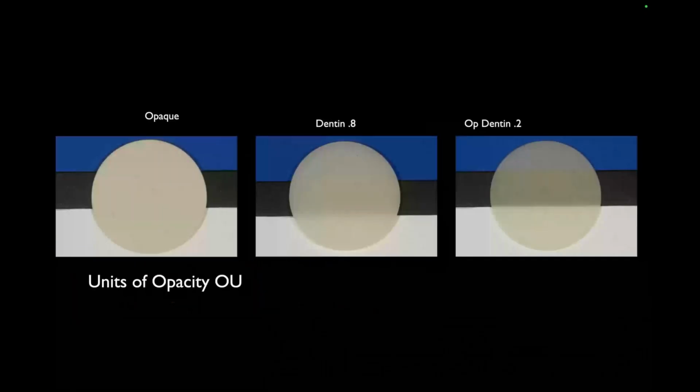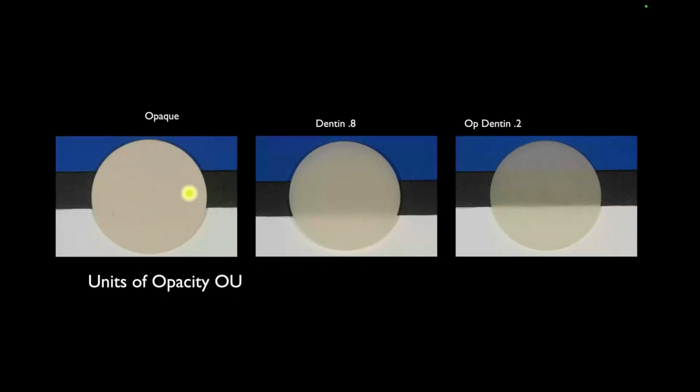So you guys need to understand that, like I said to you before, anything that has opacity to it basically stops light from going through, like opaque materials. Anything that is translucent, like your dentin materials or your enamels, allows light to go through. The question is, how much light will it allow to go through? That really varies on the material that you're using, the manufacturer of the material, and the firing schedule of the material. But just to break the misnomer that everybody seems to have, most dentin materials are only about 40-something% opacified. They range from 38 to 44.